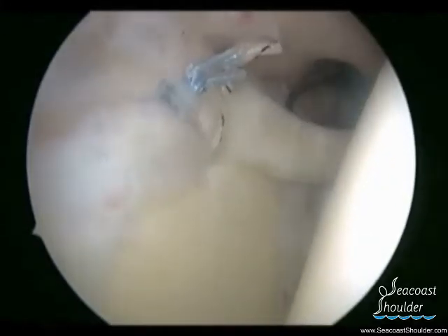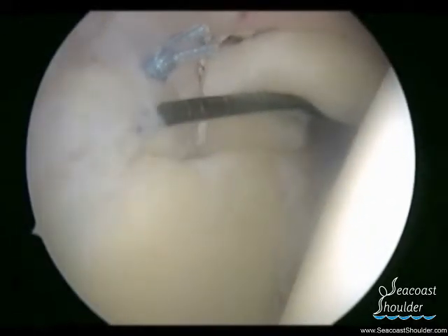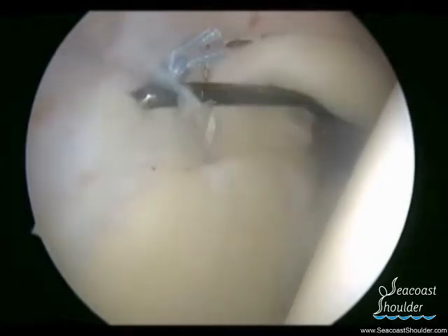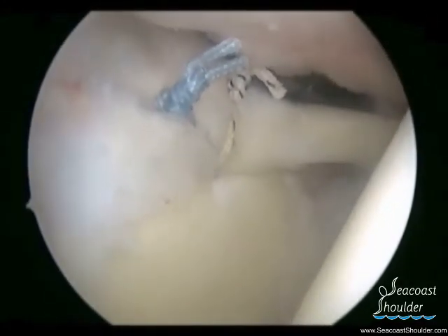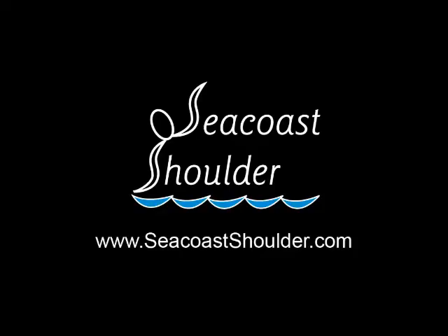Once this labral tear has been repaired, one can see that the labrum has been secured back to the glenoid, and the patient will be placed in a sling to rehabilitate their shoulder.